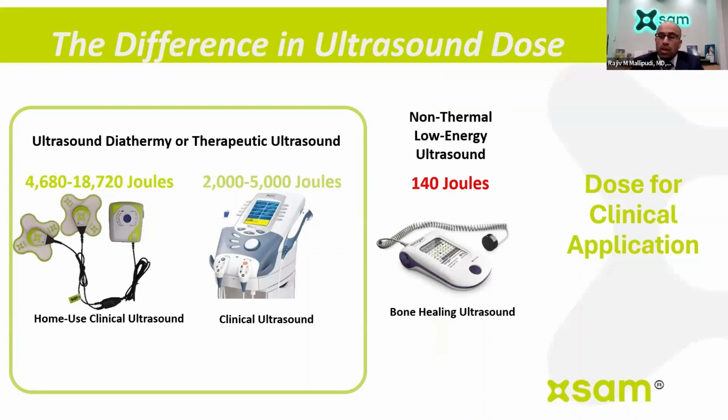When we look at ultrasound devices now, they are used with patients typically going into the office and adjusting their settings. There are 3 things that need to be adjusted: the frequency, the intensity, and also the duration and energy that's applied. Typically, patients come to the office, and you have an athletic trainer, sometimes a doctor, who adjusts the device, but they have to drive in, set up an appointment, and then they get their treatment for maybe 5 or 10 minutes, in addition to other physical therapy, and then they go home.